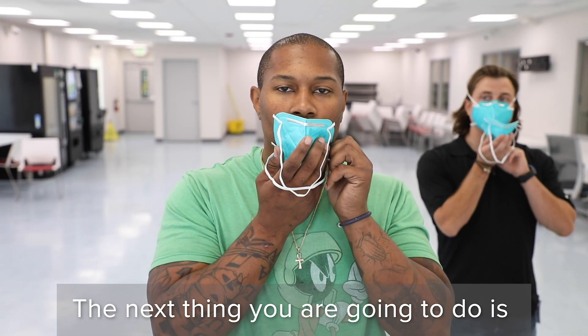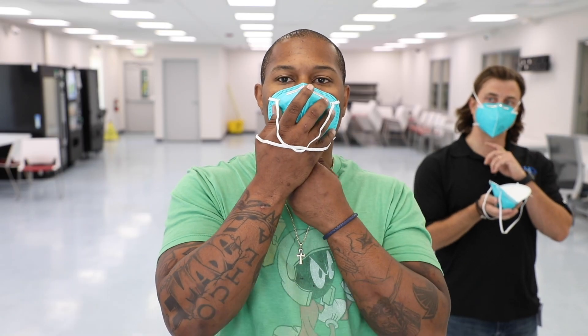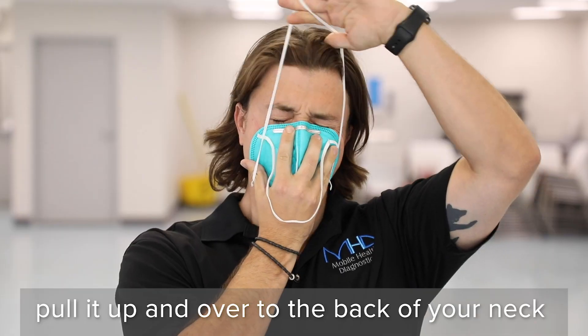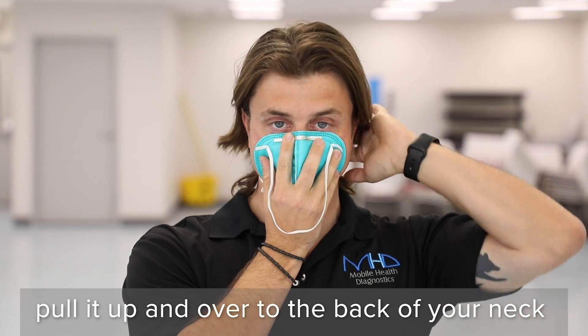Next, take that N95, put it underneath your chin and hold it to your face. Then take the bottom strap of the respirator, pull it up and over to the top of your head so that it's in the back of your neck.